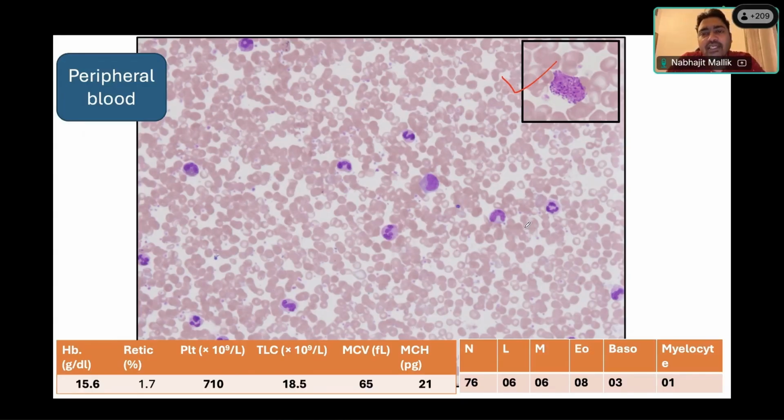So you will find some basophils which are characteristically described in your textbook, where only dark blue basophilic granules will totally cover the cytoplasm. But oftentimes you'll also find cells where the granules are not too many. Sometimes you'll also find slightly hypogranulated basophils, where the granules might be a little less. So you'll have to really recognize these basophils as well, right?